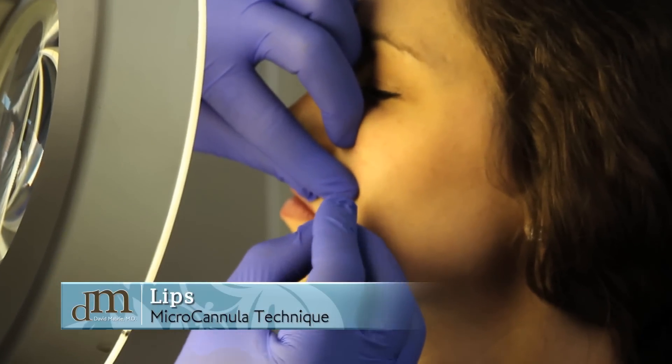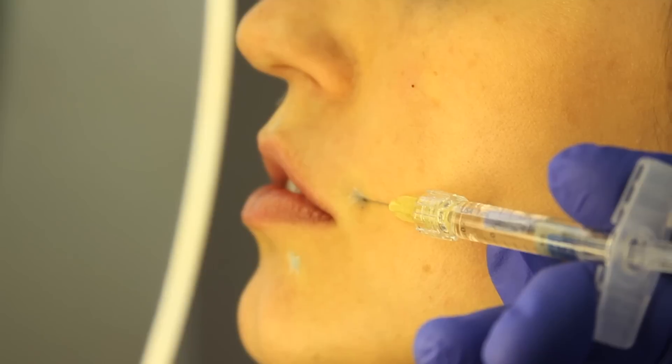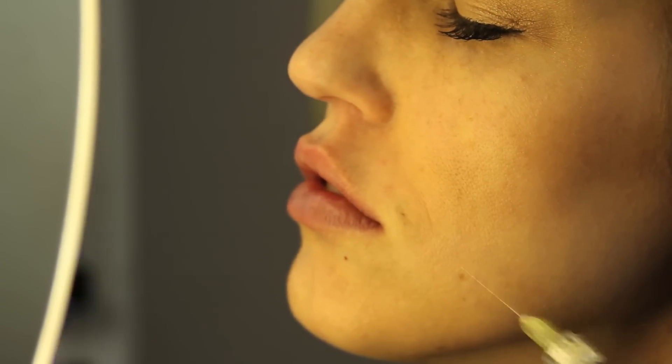One poke here. One thing I like with this technique is you can actually leave the lips closed together while I inject. Your kissability factor is rising — that's good!